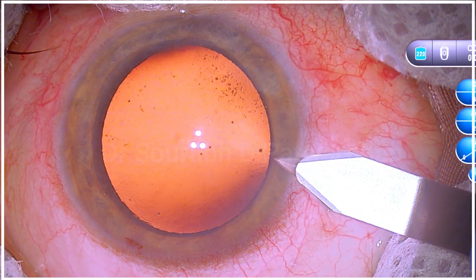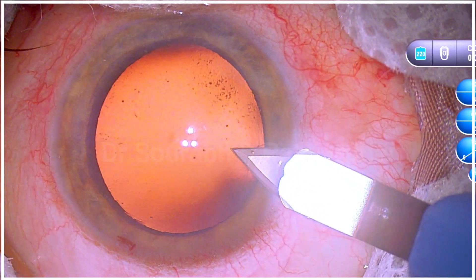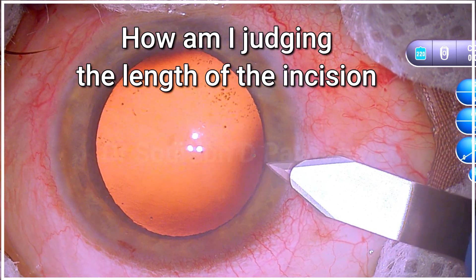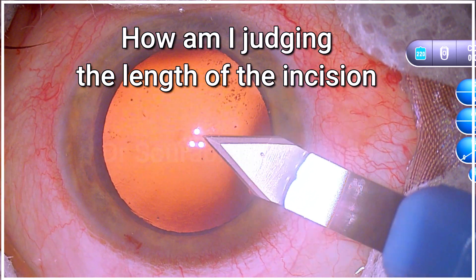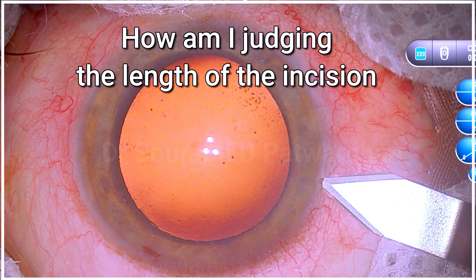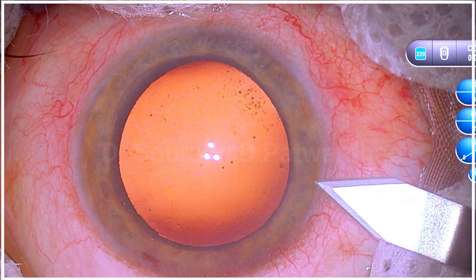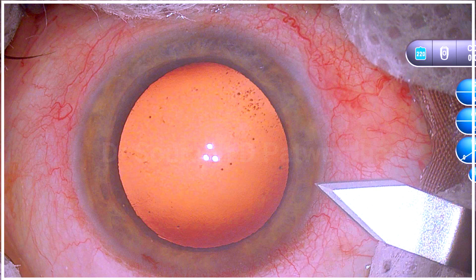Now watch this case. I am using a 2.8 blade here and making a perfect incision. Let's think about how I am exactly judging the length of the incision, because we can't see any recognizable marks on this blade, and I have not marked on the cornea as well.